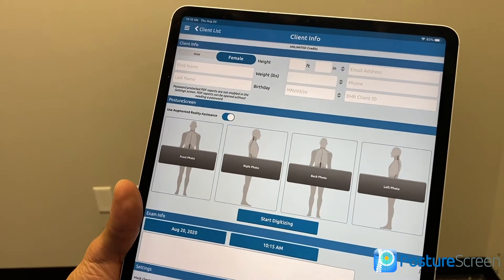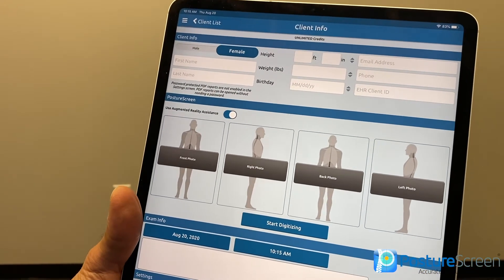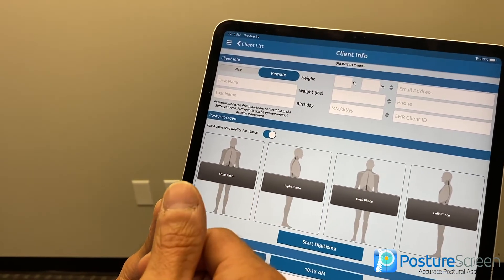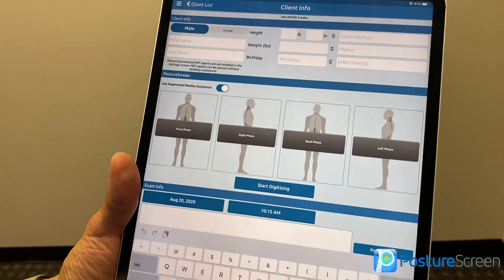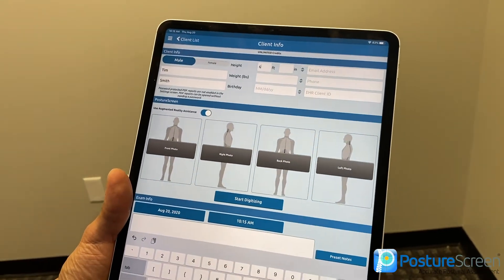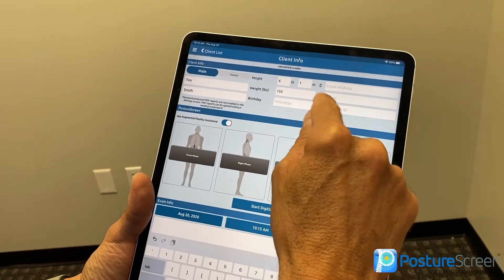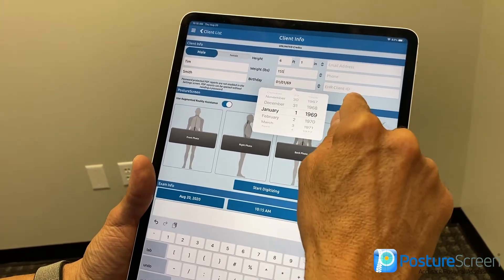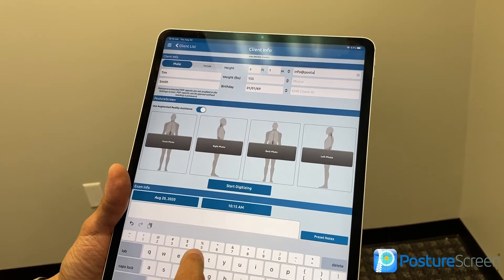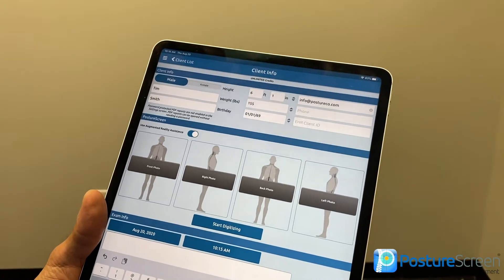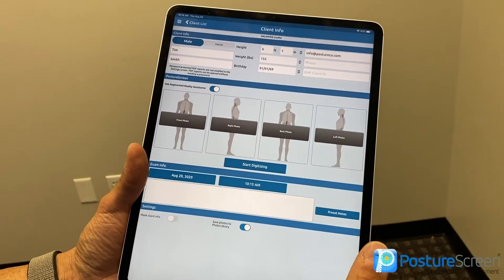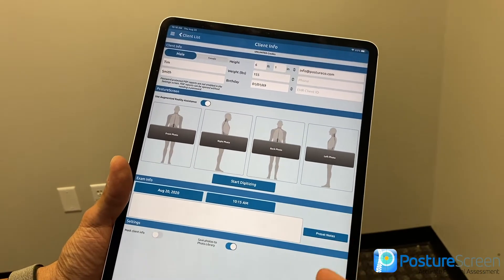At this point you get the demographic information that we're going to fill in. A quick way to see if your device supports augmented reality, or if you're not on a subscription, is to simply look at where it says Use Augmented Reality Assistance. If that's toggled off and you go to do it, it will tell you exactly what the issue is. I'm going to type in the patient information — height using the picker or by typing, a birth date, and an email address. You have a choice: a two-view is sufficient for a screening environment, but for a clinical environment we recommend all four views. In this tutorial we're going to do a two-view assessment.